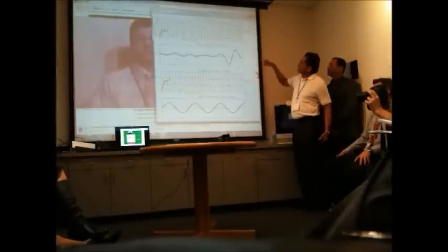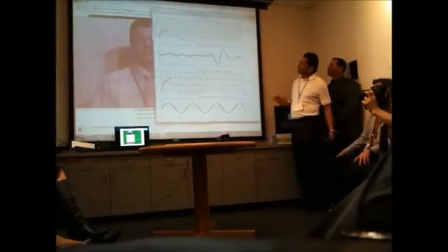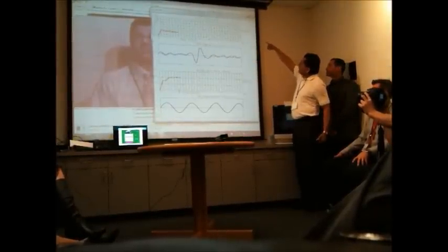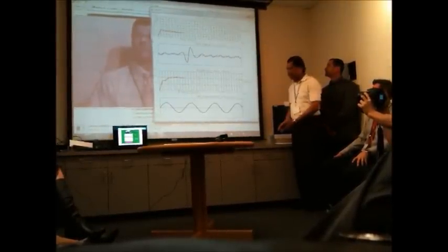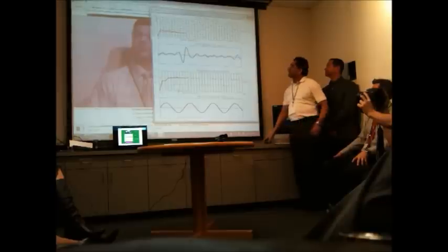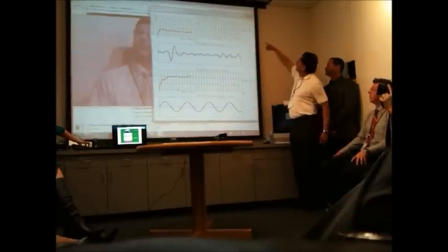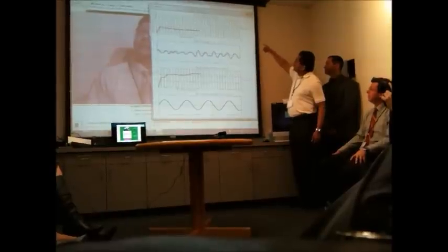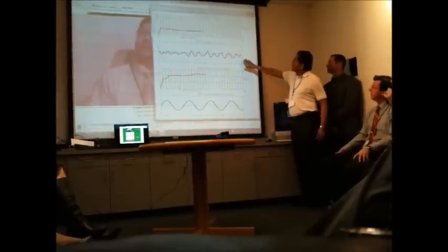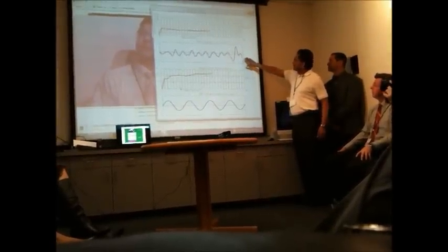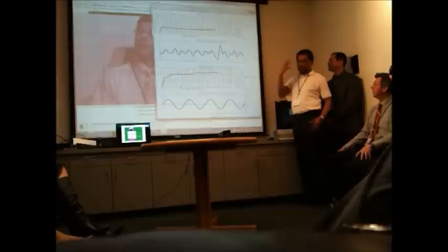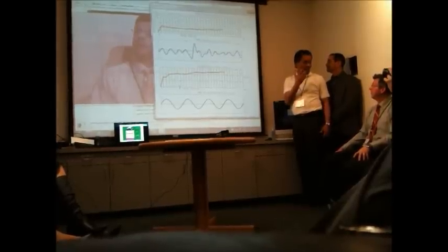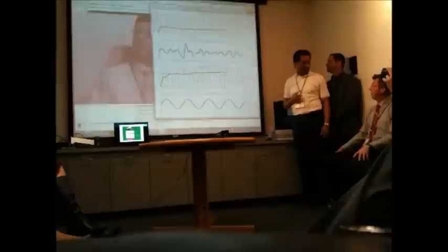Within about 15 seconds, the system starts giving numbers. The heart rate is displayed at the top. These are photoplethysmographic signals coming from the pulsation of the arteries and a bit of the veins. The reading shows 62 — you're quite healthy.